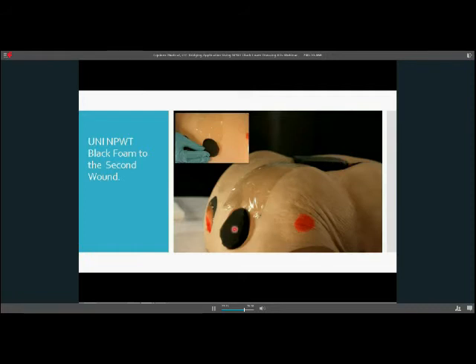Okay, so here we've got black foam in our first wound, black foam in our second wound, our bridge going across. You can see this up here. And you need to determine which wound at some point where your dome is going to be. And that will be an area that, to offload, the area that the patient is actually not going to be on.